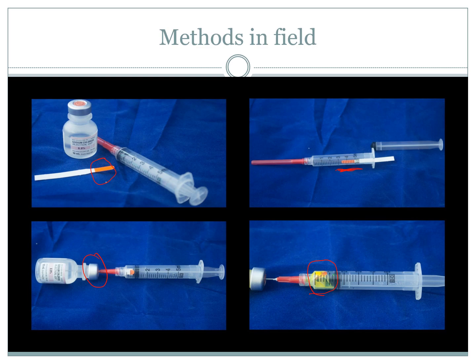Now, it almost goes without saying, but I'll say it anyway: when you're instilling it into the eye, remove the needle first. If you want a more concentrated drip, then you can use a 20 gauge cannula on the end of your syringe, but sometimes just allowing it to drop from the end of a small 3 to 5 mil syringe can be enough to cover the eye with Fluorescein itself.